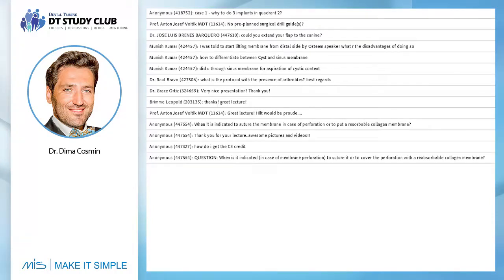That's why we kept the premolar to have retention on it, and after that we inserted the implant after extraction. Otherwise, we could not do it with only 1 implant distal because we would have had to make a provisional on mixed implant and teeth, and I don't agree with this kind of treatment.